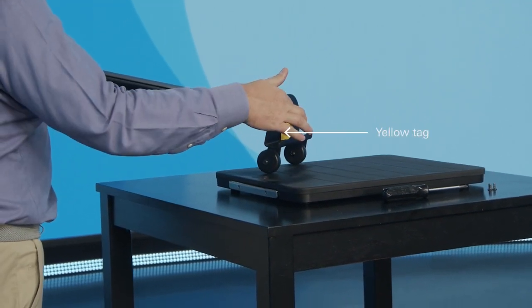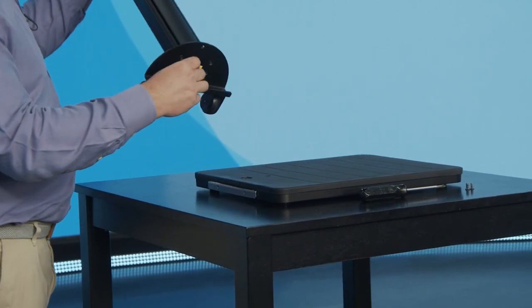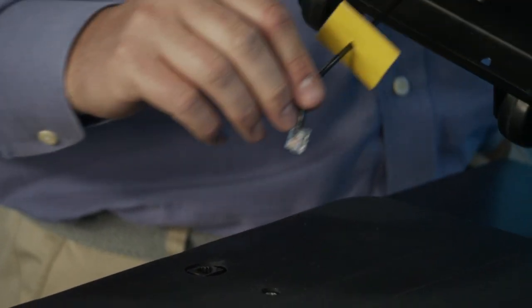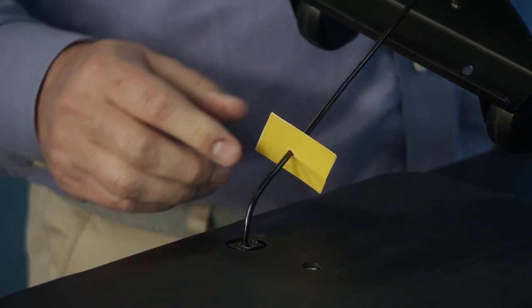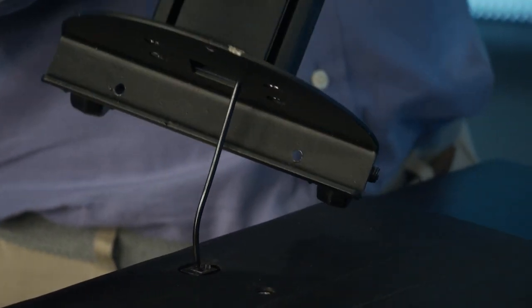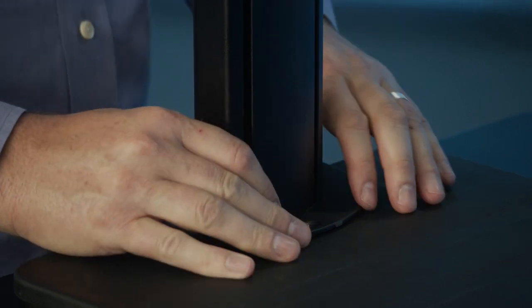There is a yellow tag at the base of the column that holds the connector in place and prevents it from being pulled back into the column before assembly. Connect the phone jack to the receptacle in the base. When connected, it will snap into place. At this time, remove the yellow tag. This tag must be removed before screwing the column into place.